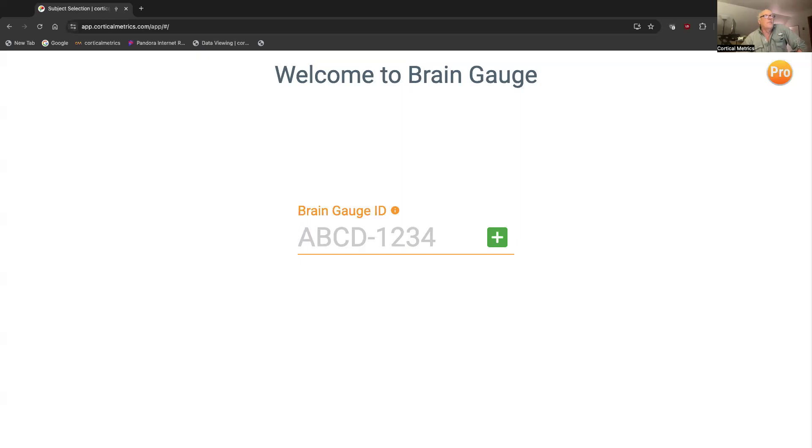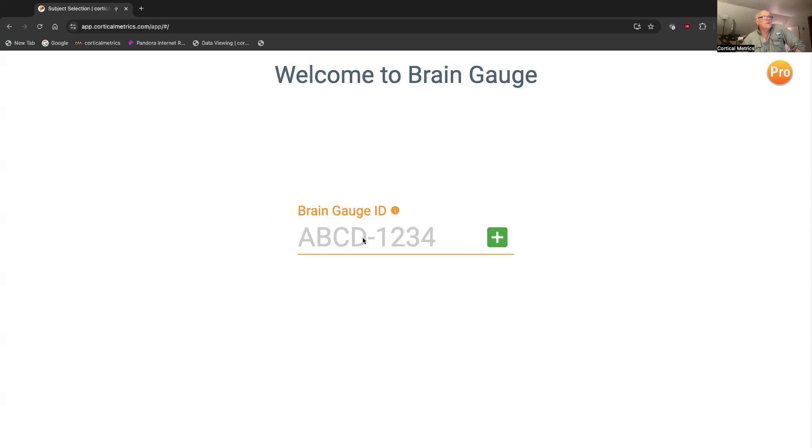When you first open the BrainGage app, the first thing that pops up is a welcome to BrainGage. And then the first question is, what is the BrainGage ID? And you wonder, what does that mean?